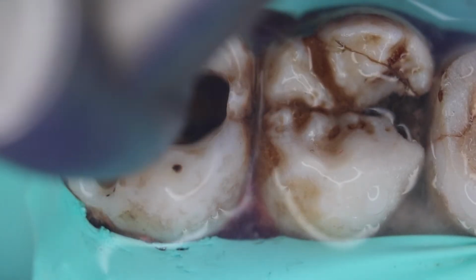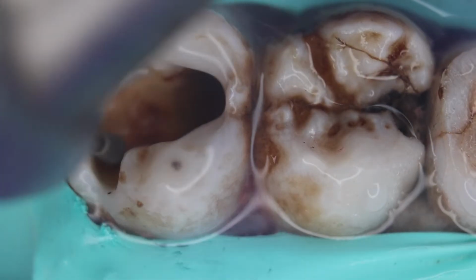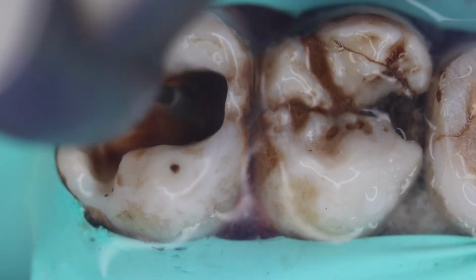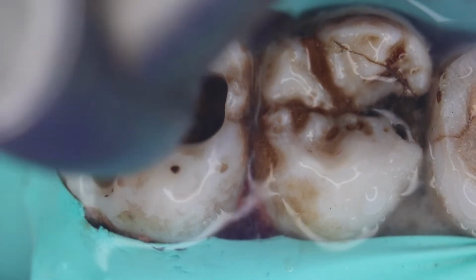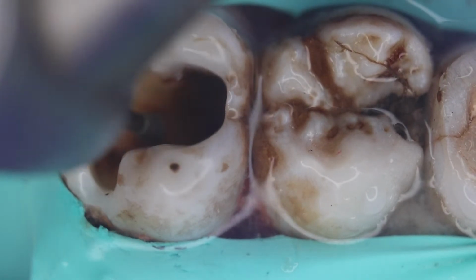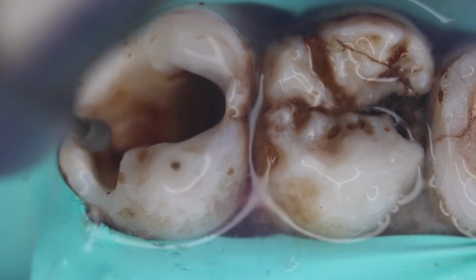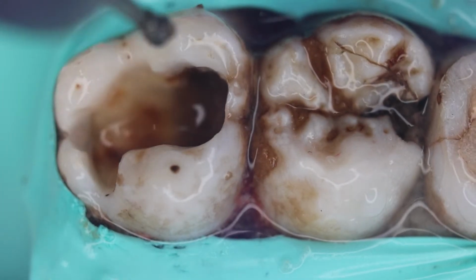So over here we are using the inverted cone. So done with this part.